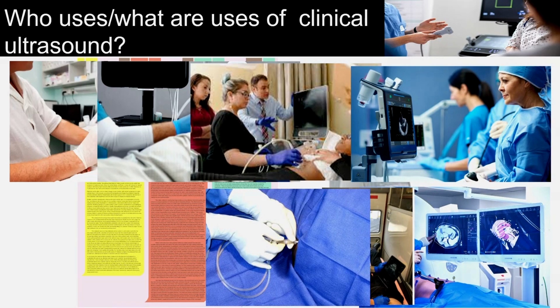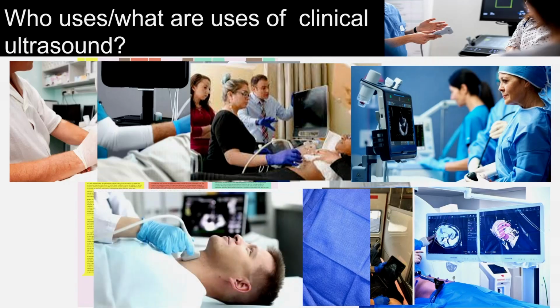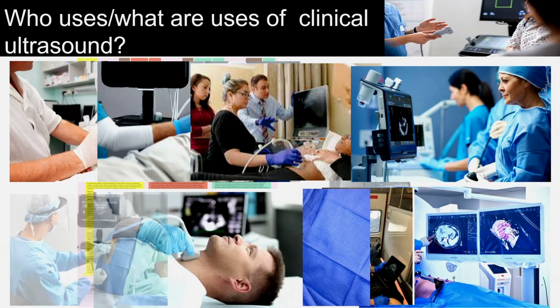Perhaps one of my physician assistants uses it to do paracentesis or thoracentesis, or as a guidance tool for that. Perhaps one of my outpatient physician colleagues uses it to assess the thyroid, or to look at the urinary bladder or the kidneys for hydronephrosis or suspected infection.